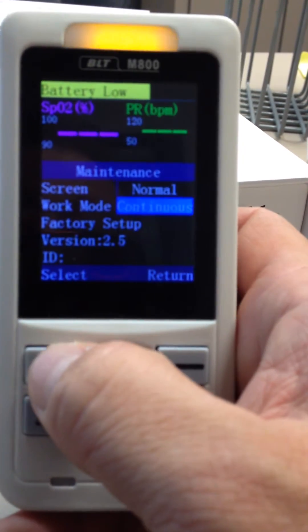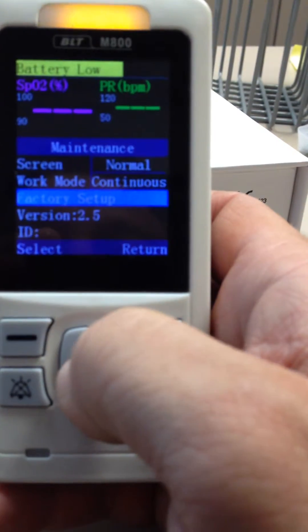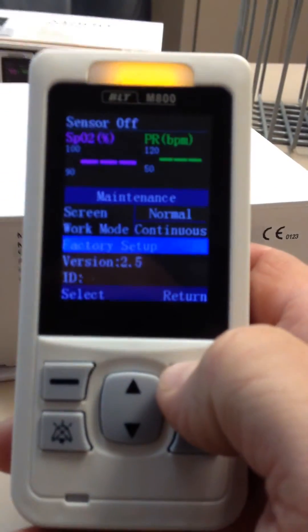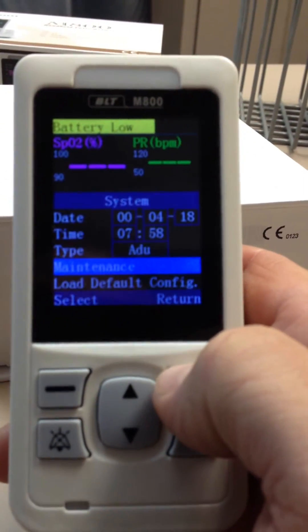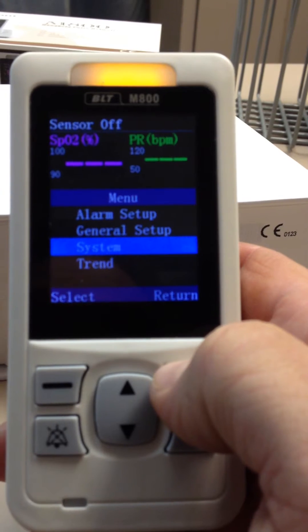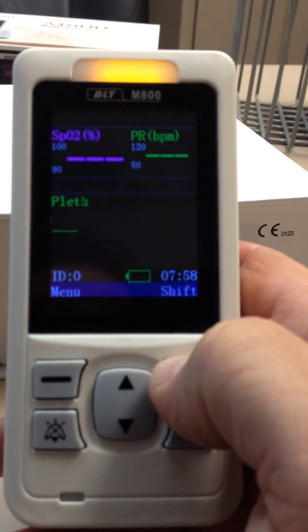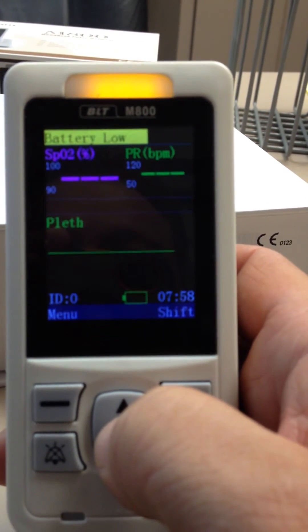Hit OK to confirm. Now you're in Continuous mode. Press Return three times to exit the menu.